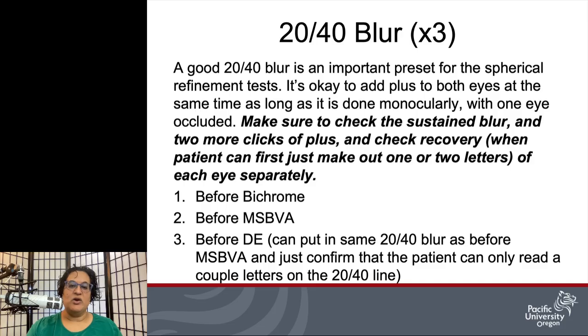You will not be required to enter your 20/40 blur values into Epic during the proficiency. You still can if that's convenient for you, but if you prefer to just remember it or have it down on a post-it, you can do it that way.